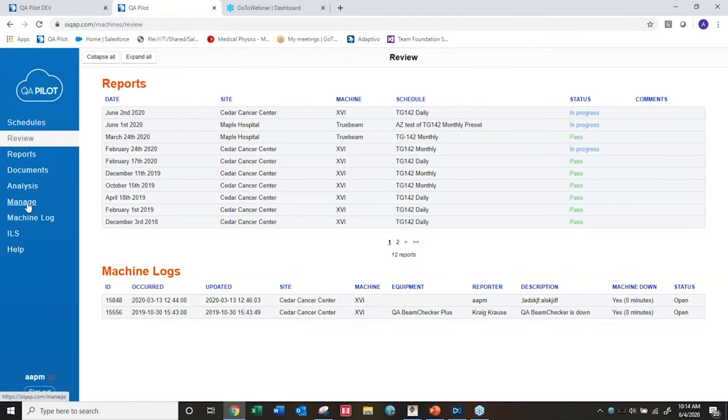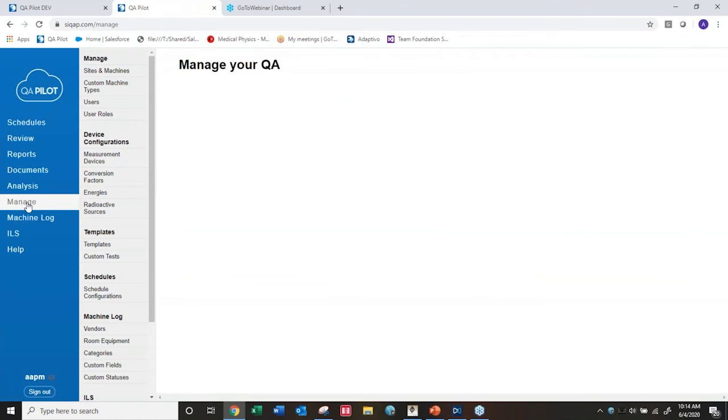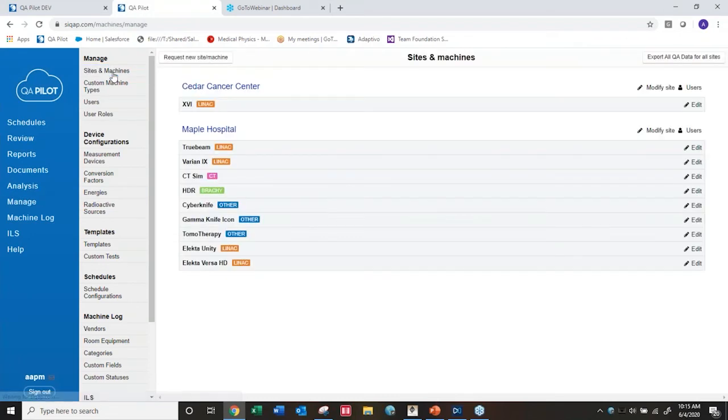So how do we actually create all of those schedules and make this function to get those dashboards and the summary views of things? Here you have your submenu of things that you are going to manage, given that you have the right user rights in order to be able to do so. So you have a space, again, your dashboard of your machines.